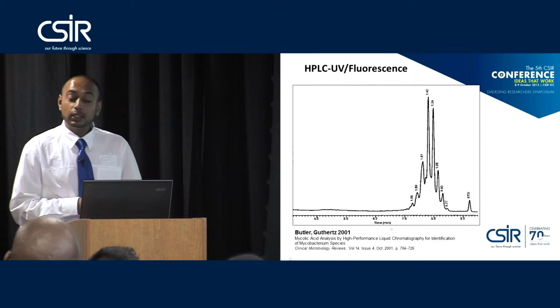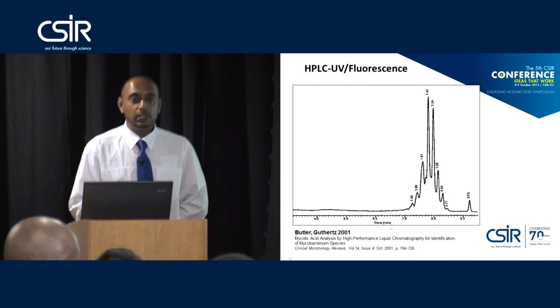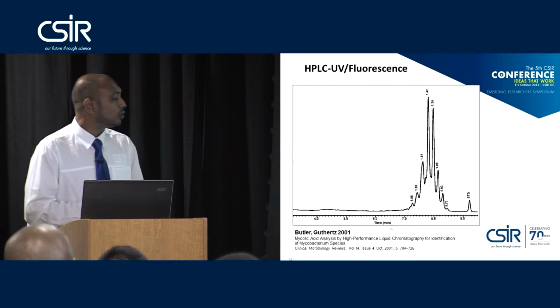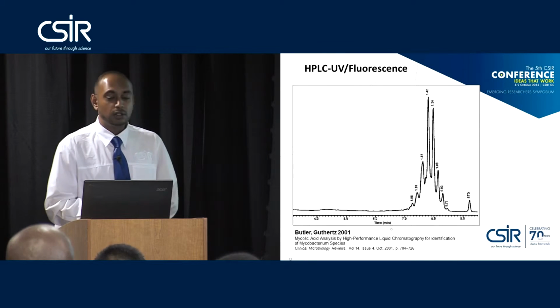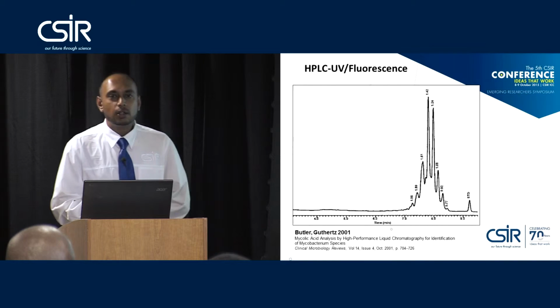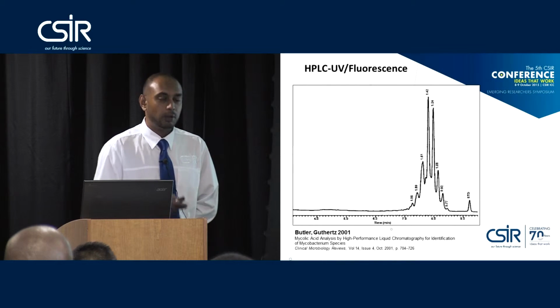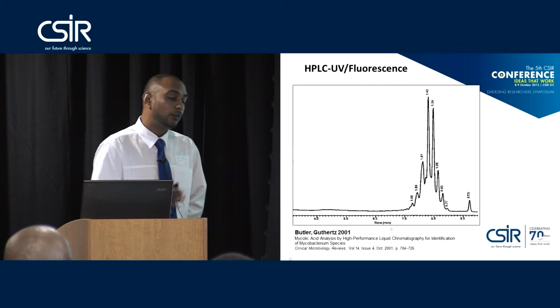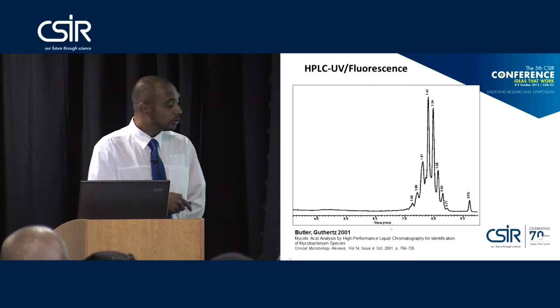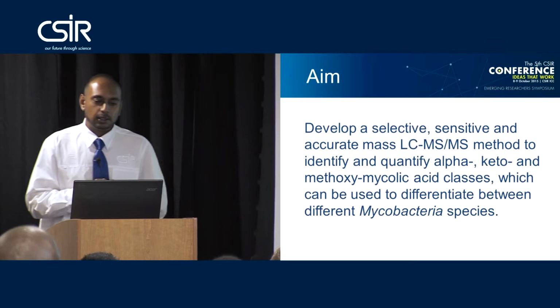Very easy for a microbiologist to look at the profile and compare the different profiles of the species, but of course a chromatographer or analytical chemist will come along and say this chromatography does not have sufficient resolution to identify the eluting compounds. Nonetheless, this was performed for almost a decade before the molecular and PCR tests came along, and because of their rapidity and accuracy as far as confirming the genotype is concerned, not the phenotype, took over in the laboratories.